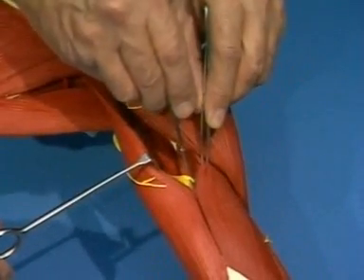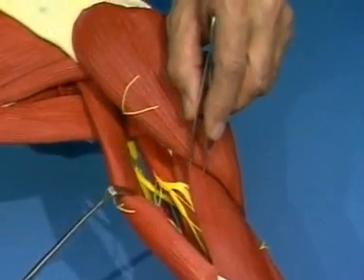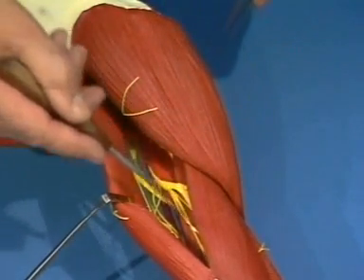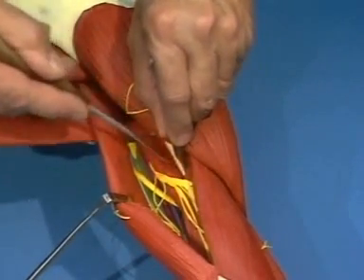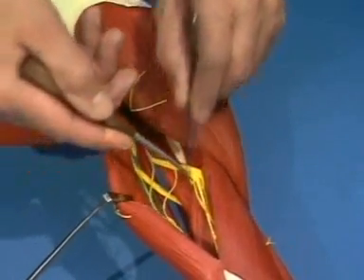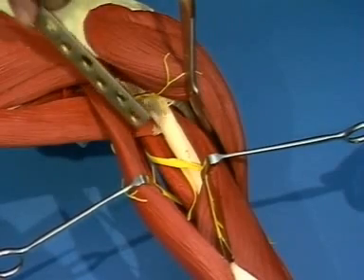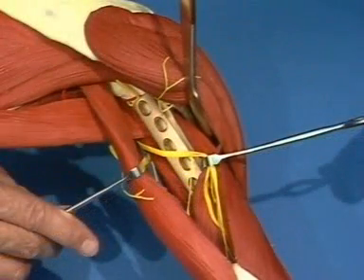These are bluntly separated down to the aponeurosis. On the floor of the V-shaped interval are the radial nerve and deep brachial vessels. These descend obliquely and laterally across the deep medial head of the triceps. The medial head of the triceps must then be detached, allowing a plate to be placed on the humerus underneath the radial nerve, deep brachial vessels and the medial head of the triceps.